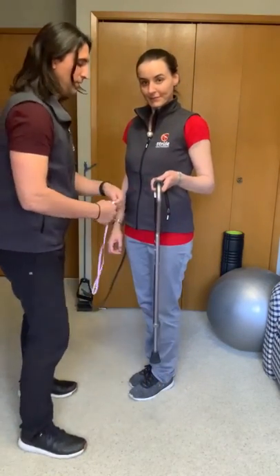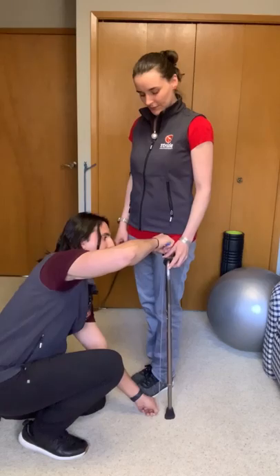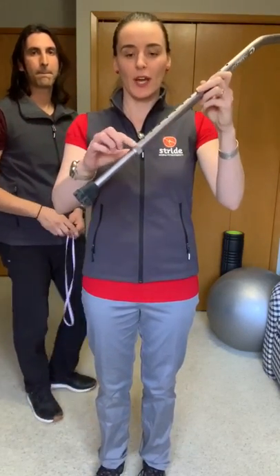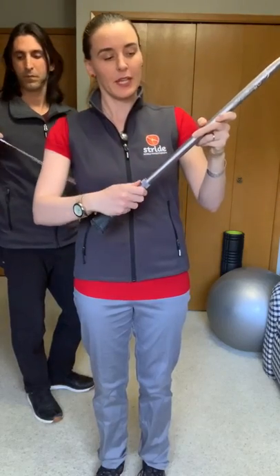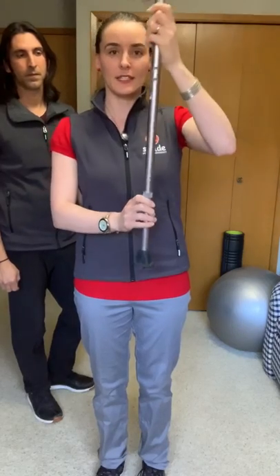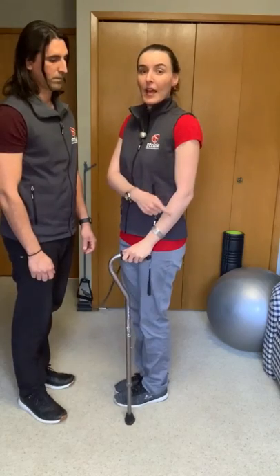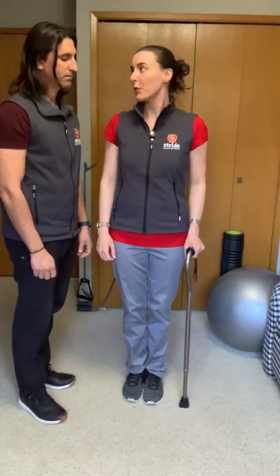So now we're going to measure the cane to see if it's appropriate for Becky. It's 32 inches, so we have to bring that cane one inch up. Most canes will have this system of adjustment — you have a screw piece at the bottom, which is the lock, which you need to loosen. Then there's a pin that you press in and you move the bottom half down until it snaps into the next position. Tighten the ring at the bottom and you're adjusted. As you can see, it is now an appropriate height — I have a slight bend of about 20 to 30 degrees in my elbow, my shoulders are flat, and I'm ready to go.